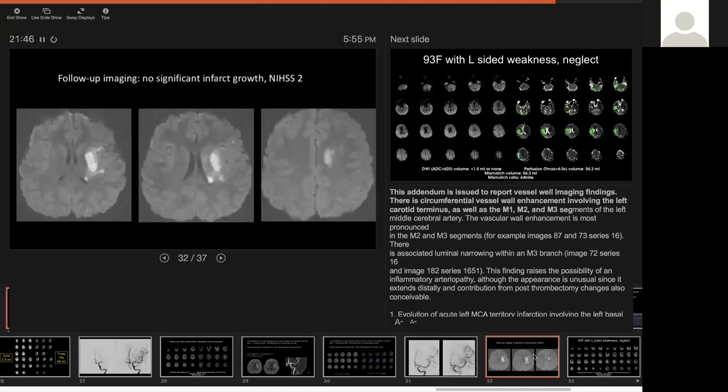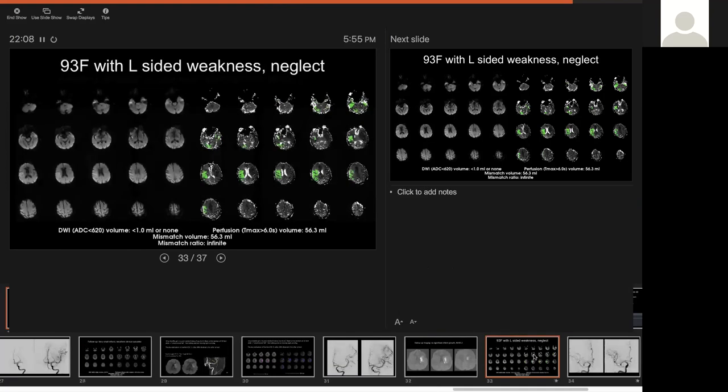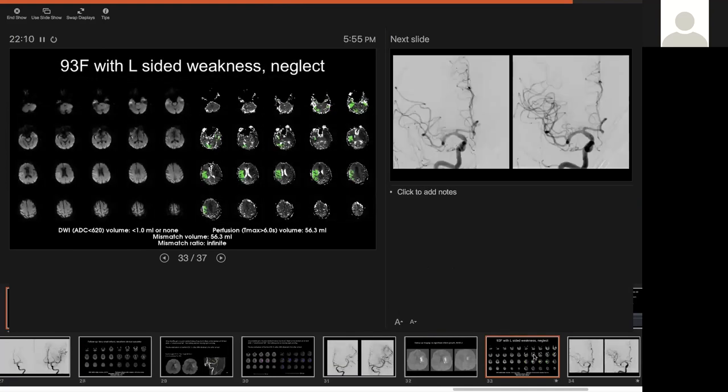And here you can see all of that blue area that seemed to be clinically relevant, because she was still aphasic when she went into the cath lab, has been saved, and she wound up with an excellent outcome with an NIH score of 2. So we've done about a dozen kids with this type of imaging, and that's what we're trying to put into a 25-center trial. I'm going to finish up with, again, the opposite end of the spectrum from the kid.